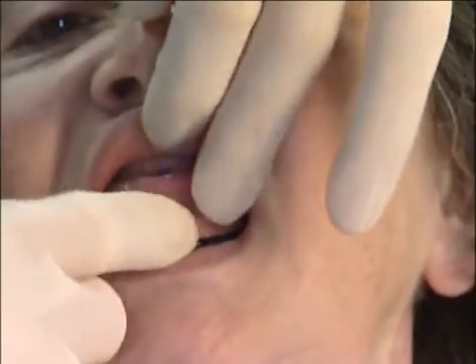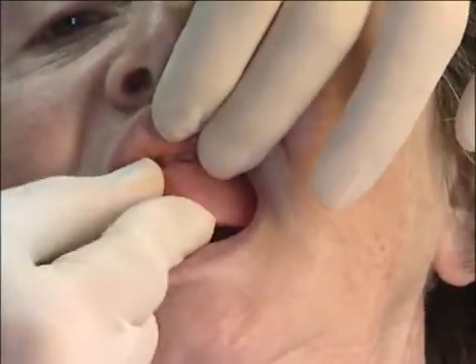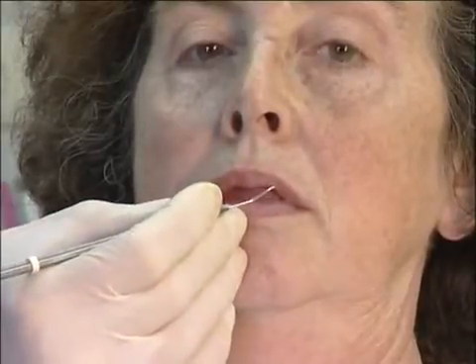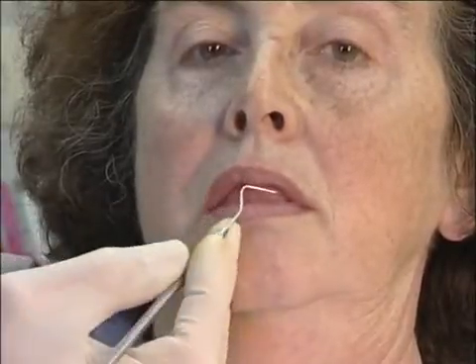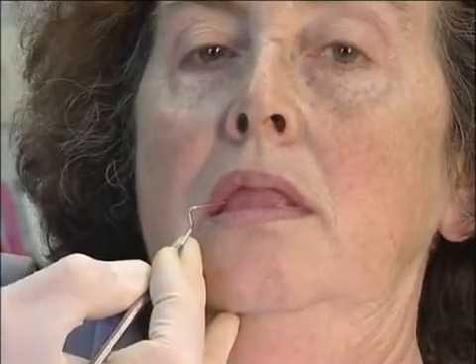The aesthetic parameters are transferred with a sheet of soft wax. The wax mask is adapted over the front of the fixed centric registration. The dentist uses a wax knife to mark the lip line, midline, canine line, and smile line.